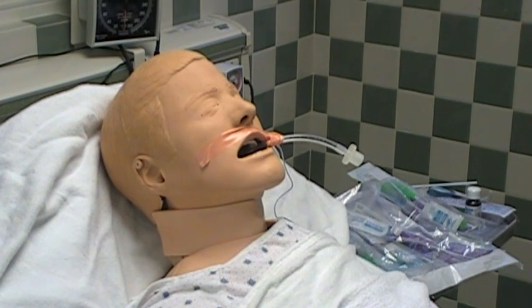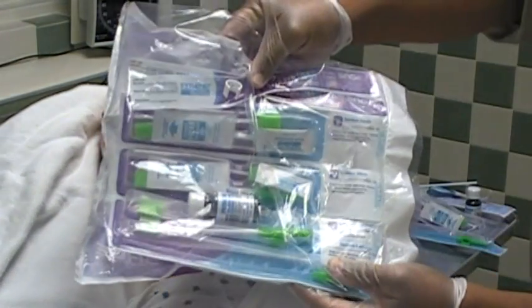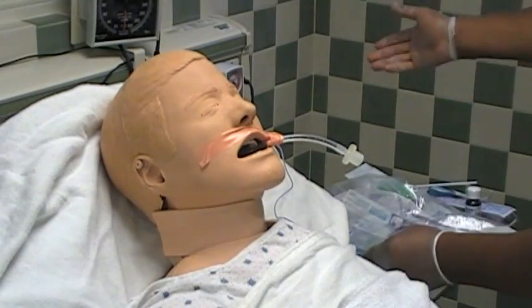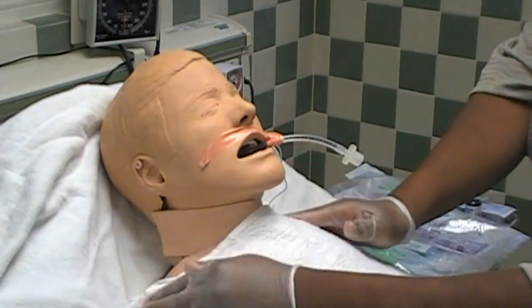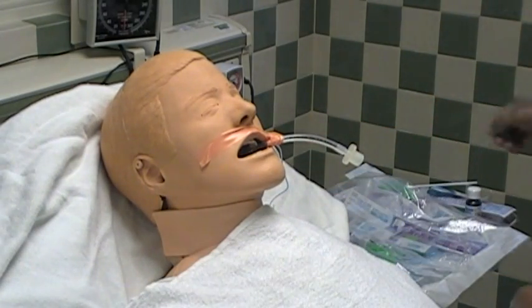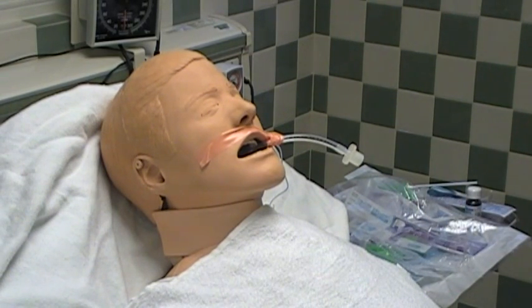Always check with your patient's nurse before, and just make sure it's okay to do mouth care at this time and on this patient. Tyrone has already washed his hands and put on gloves, but now we need to gather the supplies — the sage kit. Make sure your suction tubing and suction canister is set up and the suction is working. You may want to place a towel or washcloth under the patient's chin if there are a lot of secretions. Always ask the nurse if you can raise the head of the bed or position the patient's head to the side.